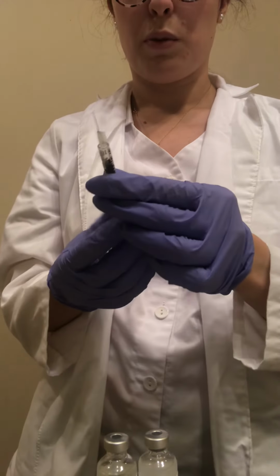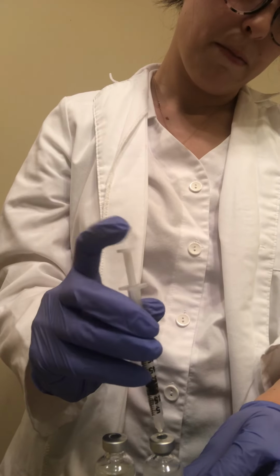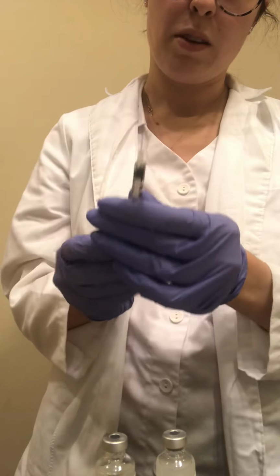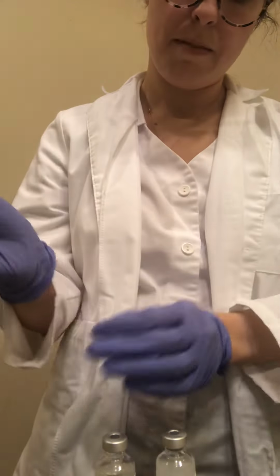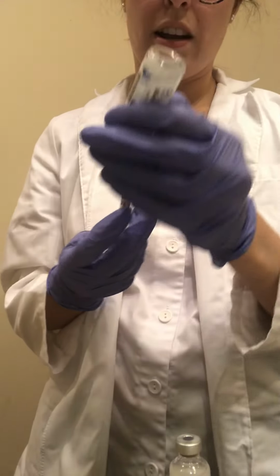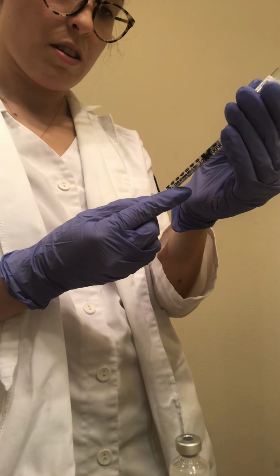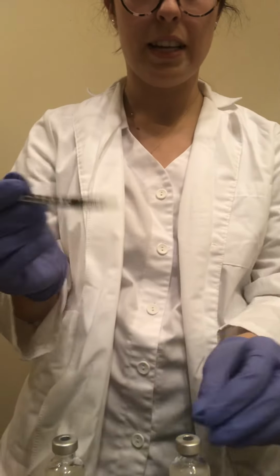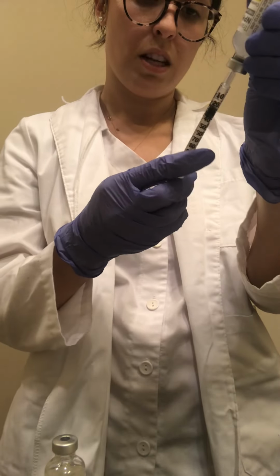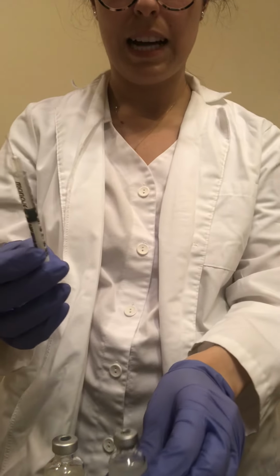Okay, so this is 20 units of air, like I said, that I'm going to inject into here. This is the cloudy NPH insulin. All right, 20. Draw up another 20. Go into the regular. Draw it up like so. All right, so that's 20 units of regular insulin. And then we're going to draw up the 20 units of NPH, so 40 total units of insulin.